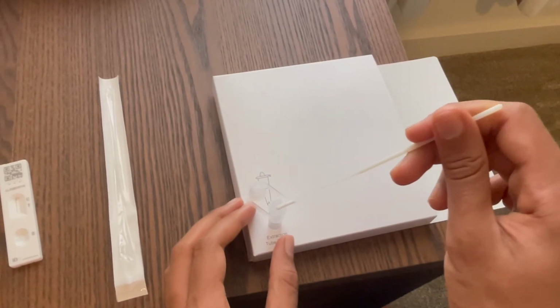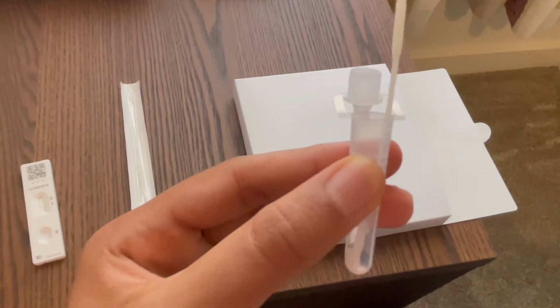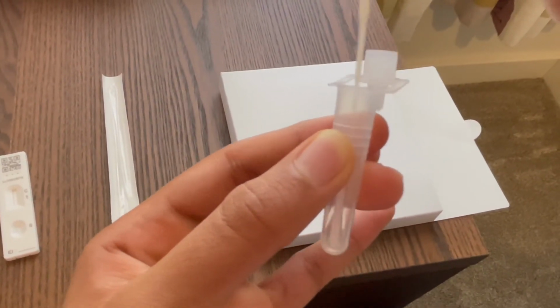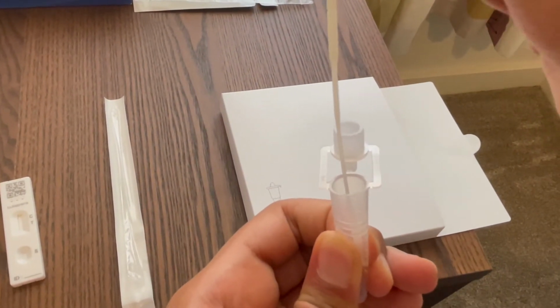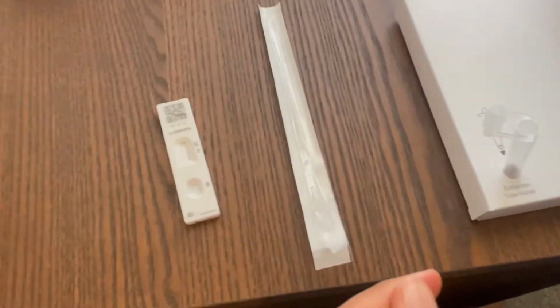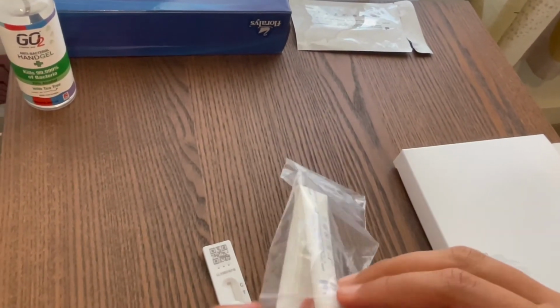Now, to process the sample, pick up the extraction tube and place the fabric tip of the swab into the extraction tube so it's in the liquid. Press the tip against the extraction liquid with force while rotating it around the extraction tube for 15 seconds. This is to transfer your sample into the liquid. Pinch the extraction tube against the swab as you remove it. Make sure you remove all the liquid from the soft tip of the swab. Now, place the swab in the plastic waste bag provided.